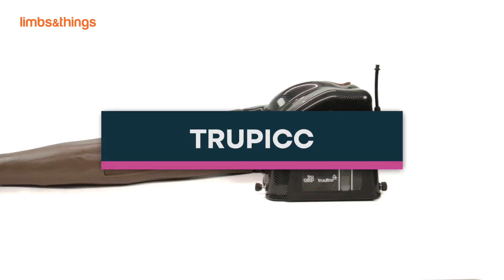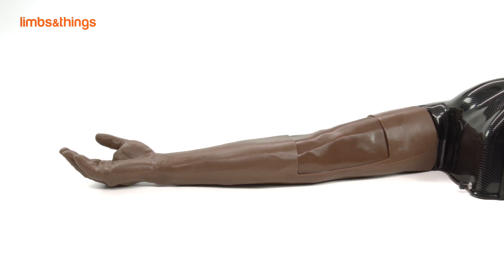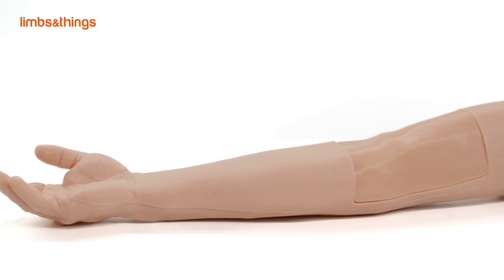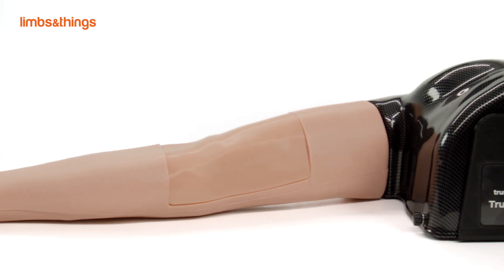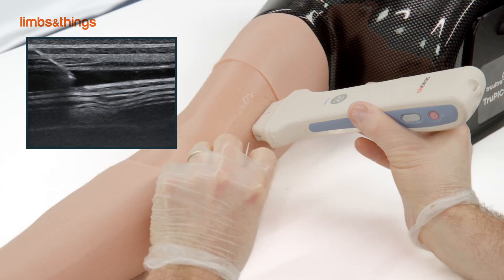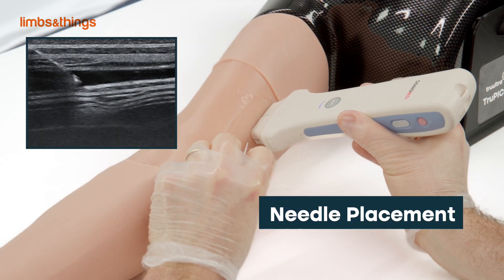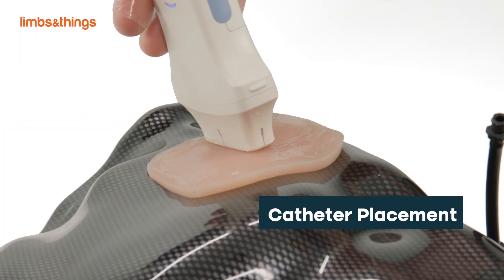TruPic is part of the TruUltra range. TruPic is an automated adult male arm designed for teaching the skills associated with ultrasound guided PICC line and intravenous techniques. This model is ideal for developing skills associated with needle placement, guide wire, and full catheter placement using ultrasound.